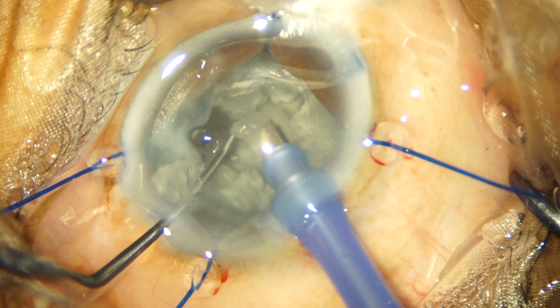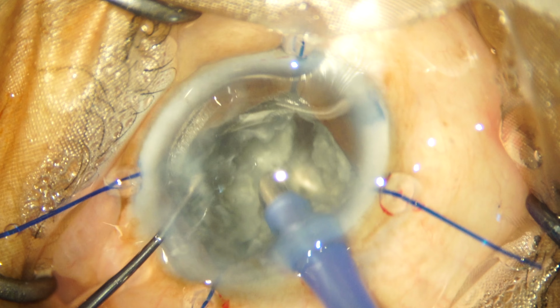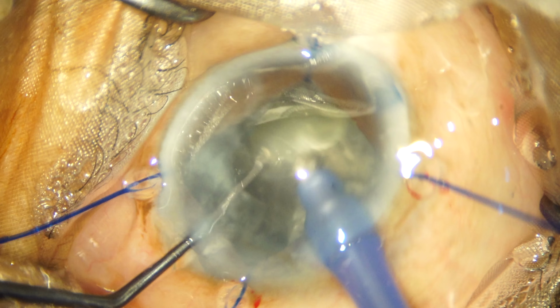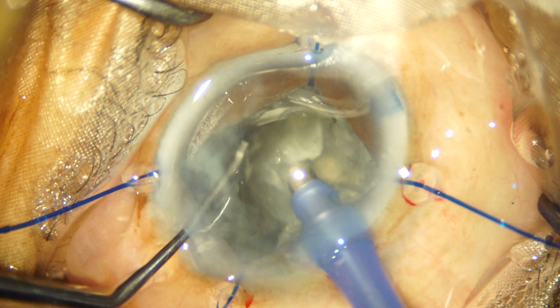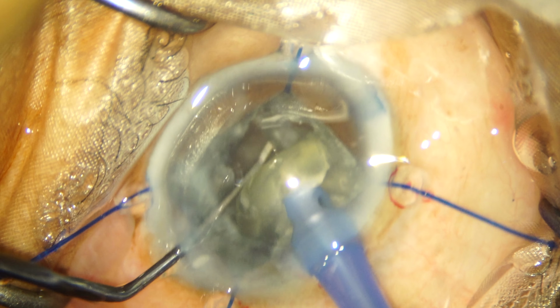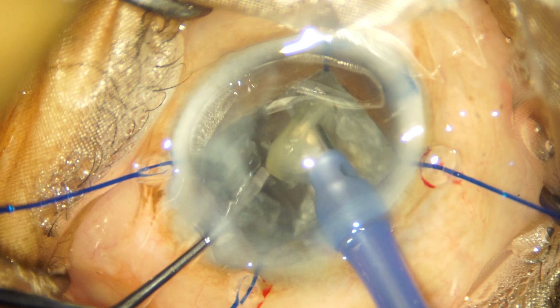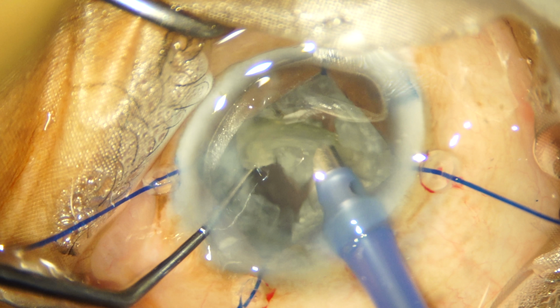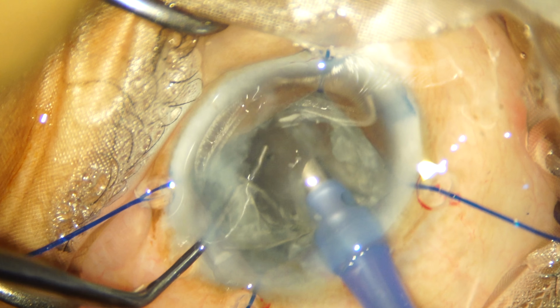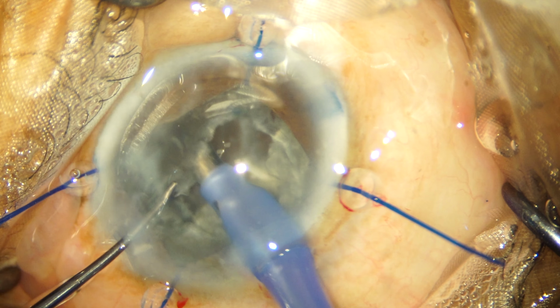So that's the second part of the posterior nuclear plate, which I have now finally emulsified. And then I go forward with the fragmentation and emulsification of the individual nucleus pieces. I've tried not to edit out too much of the emulsification process, as I wanted to highlight how the nucleus was handled in such a case.